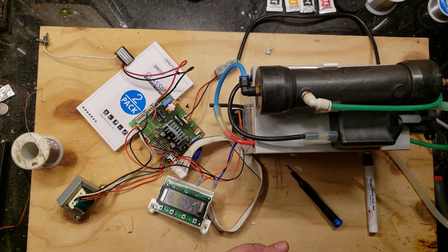Okay, where was it? It is right here. Come on, melt. Yeah, I've been doing percussive desoldering on these little things since I was a kid. Works very well, doesn't require any external tools or anything, even though I have a proper desoldering iron with a pump and everything. With a little circuit board like this that's not shock sensitive, percussive desoldering works. Come on, come out.